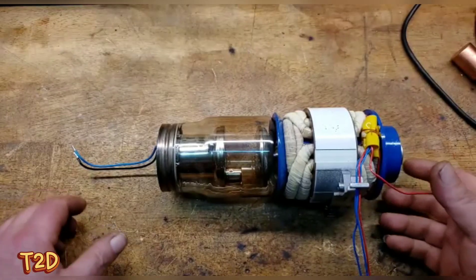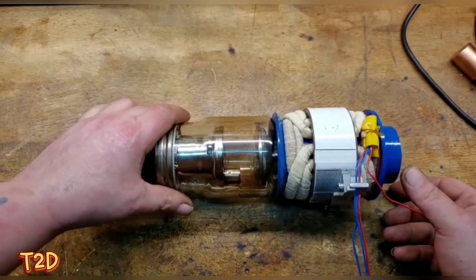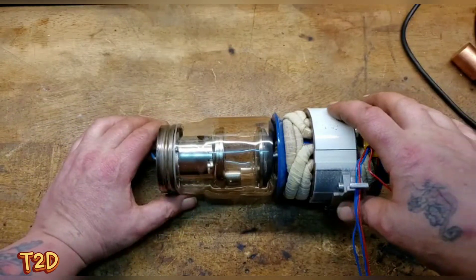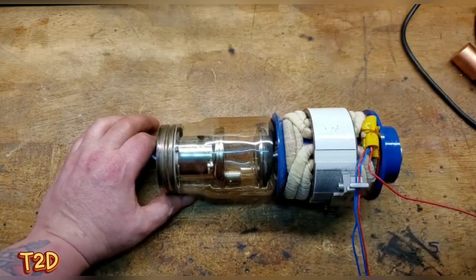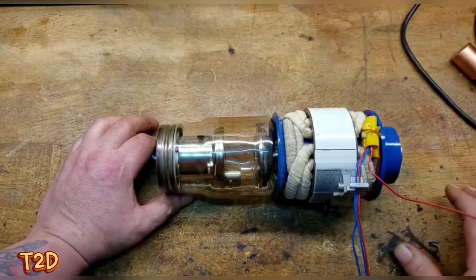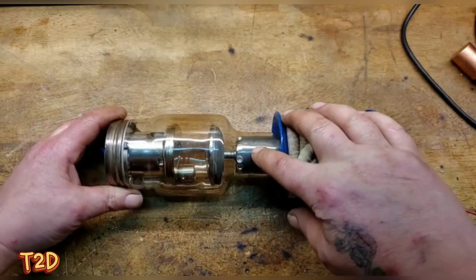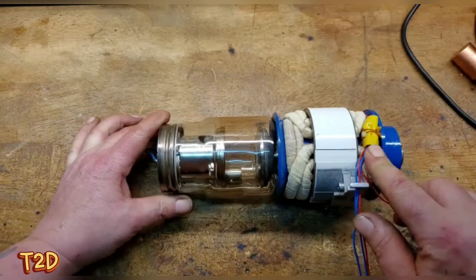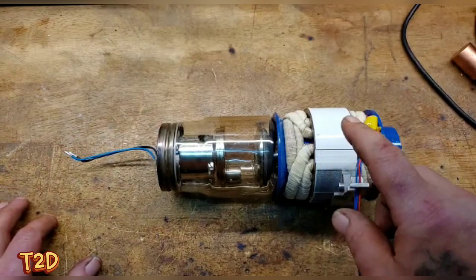This is the tube removed from the housing - a rotating anode tube - and this is the stator. For anyone who understands how an induction motor works: you have a stationary stator and a rotor that rotates. On this tube the rotor is actually inside the vacuum tube and it rotates the anode. Before we go further, we'll look at a normal x-ray tube and cover the x-ray physics.